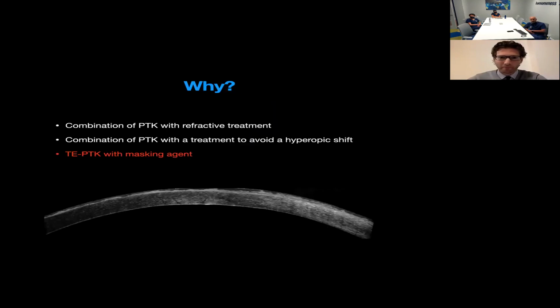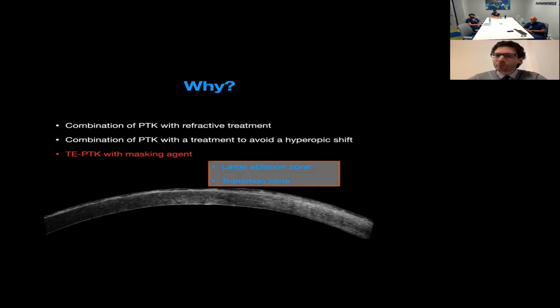And so what instrumentation or devices do you think are important for people who are considering these kinds of treatments? What should they have in their devices? Whenever we are planning this, it is good to have an OCT and be able to measure the actual thickness of the fibrosis. It's very useful, because you can perfectly plan the treatment that you're going to do. Before having these OCTs, before being able to measure this so precisely, we used to do it with the slit lamp. We just guessed whatever the thickness was, and we tried to aim for the perfect thickness.